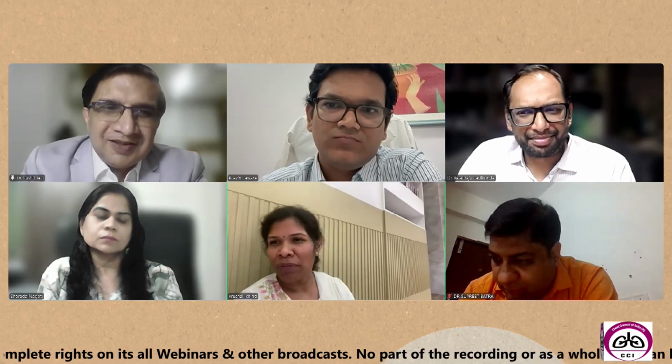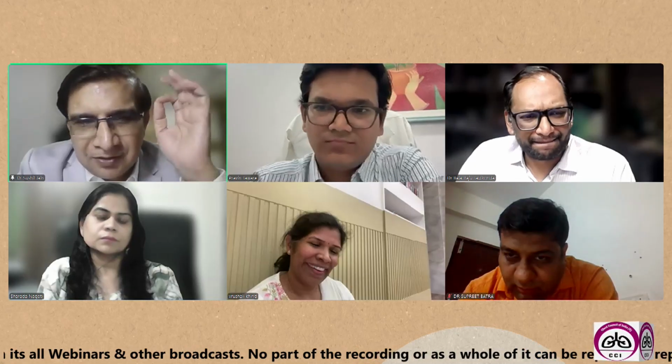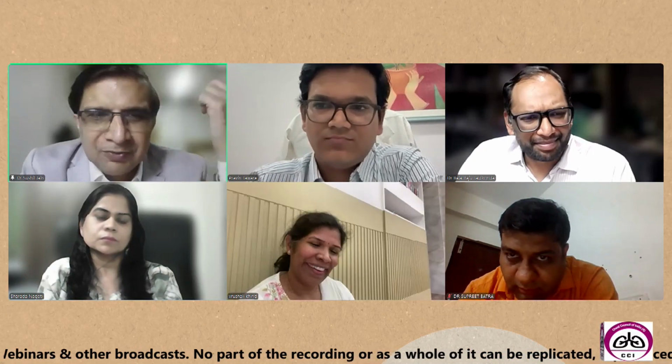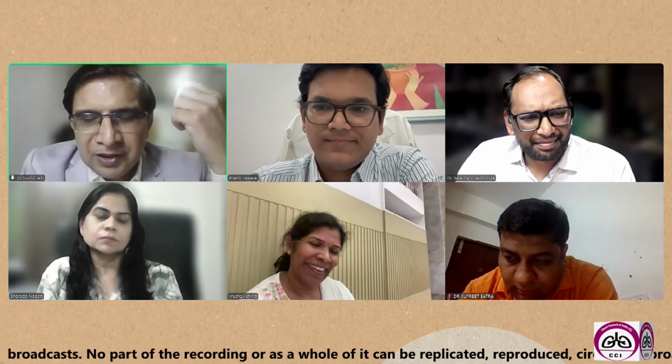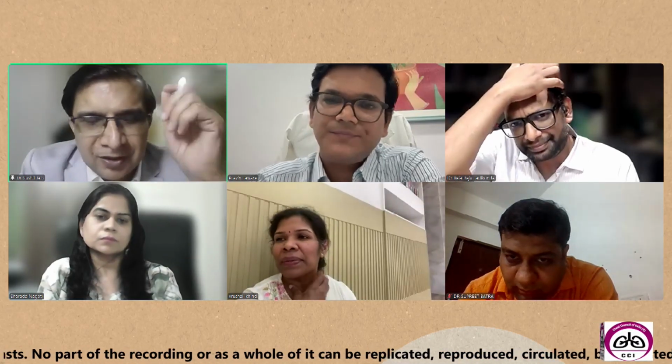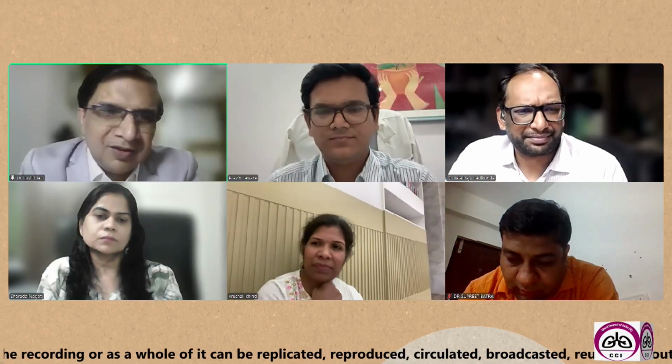A question for everyone, actually. I think I always use a stylet and then clean the tip while juggling the stylet a little bit, remove the stylet, put the suction, and then before removing, again do the juggling of the needle, and then stop the suction, remove the needle. And that's the standard way we practice, and we are doing fine.